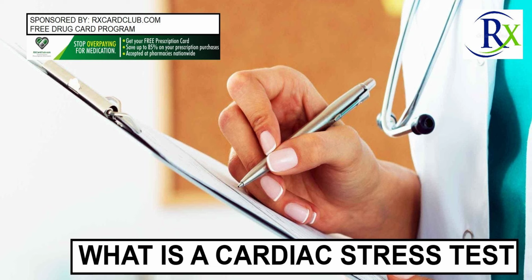A cardiac stress test is a valuable tool for diagnosis. Despite its limitations, it can offer important insights that may lead to the early diagnosis and treatment of CAD and atherosclerosis. Moreover, it is a relatively affordable test that doesn't expose you to radiation or chemicals. To better ensure test accuracy, always follow your healthcare provider's instructions without exception. Moreover, try to find a dedicated cardiology practice with its own stress lab or a hospital with a dedicated cardiology unit.